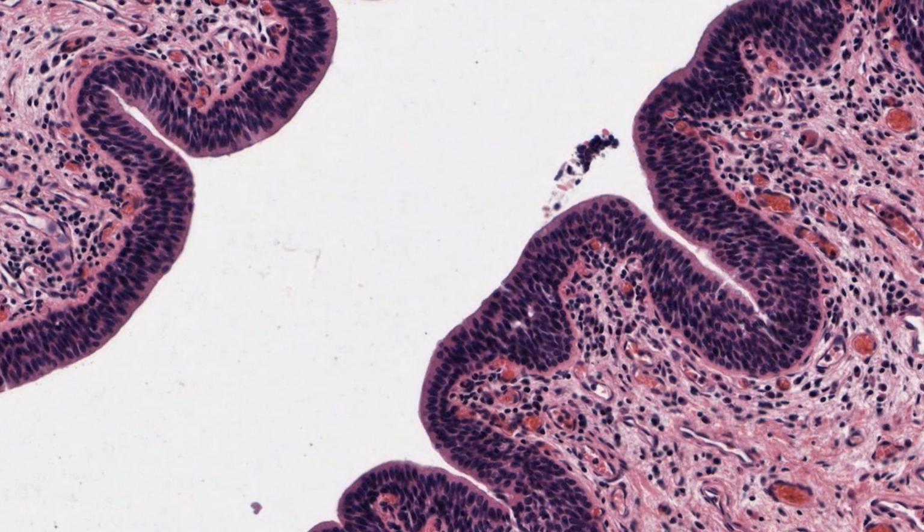The basal lamina is synthesized by the epithelial cells, but the additional material you can see here is synthesized by the underlying connective tissue cells. Some epithelia do not have a basement membrane, but almost all have a basal lamina.